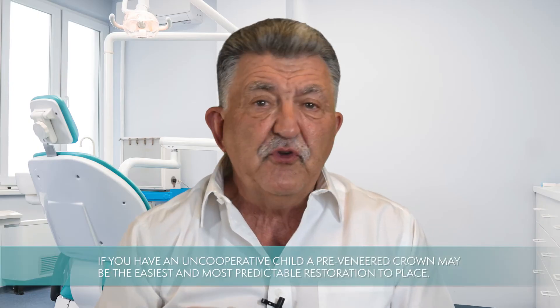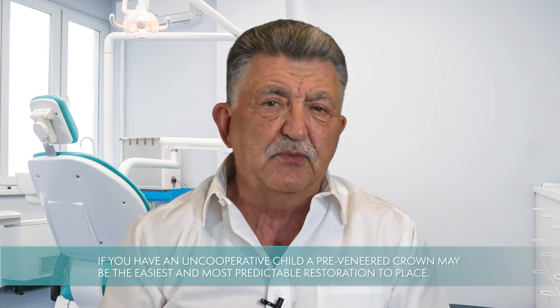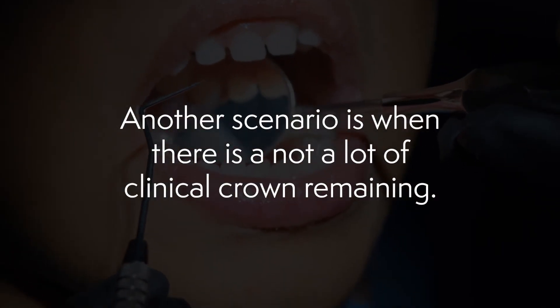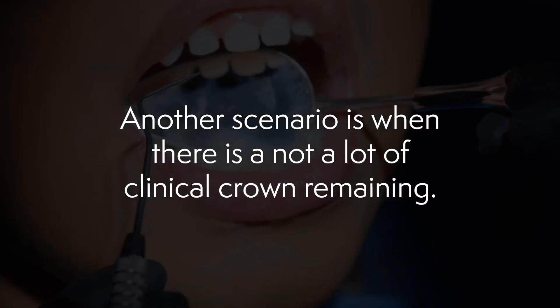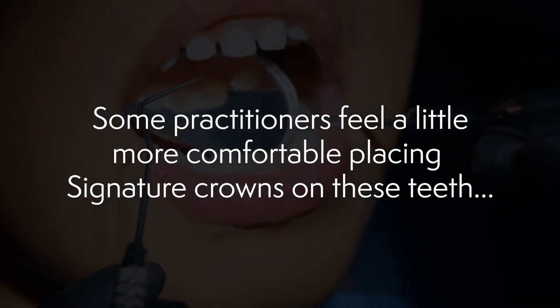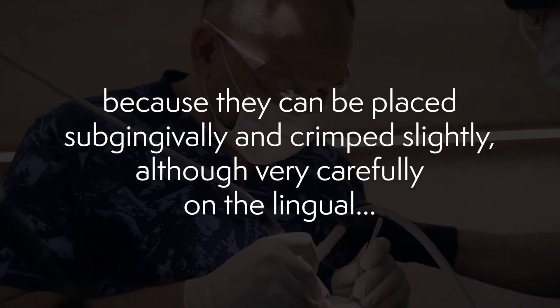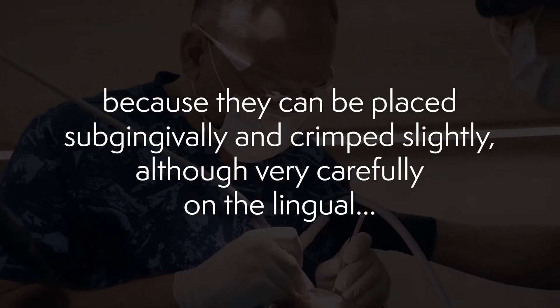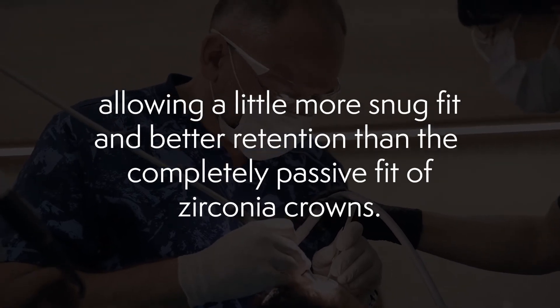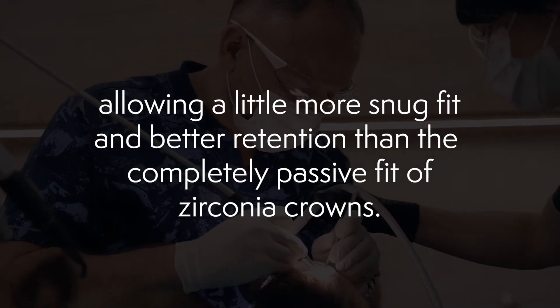Secondly, if you have an uncooperative child, a pre-veneered crown may be the easiest and most predictable restoration to place. Another scenario is when there's not a lot of clinical crown remaining. Some practitioners feel more comfortable placing signature crowns on these teeth because they can be placed subgingivally and crimped slightly, although very carefully on the lingual, allowing a snug fit and better retention than the completely passive fit of zirconia crowns.